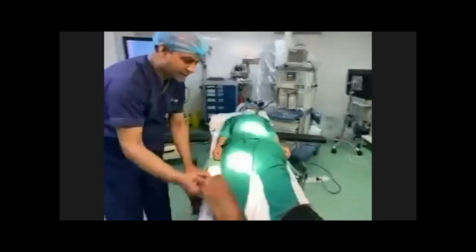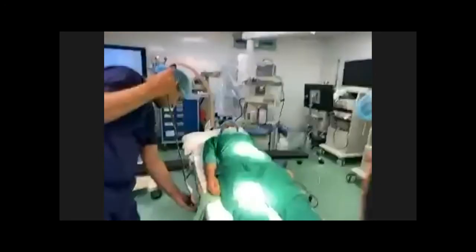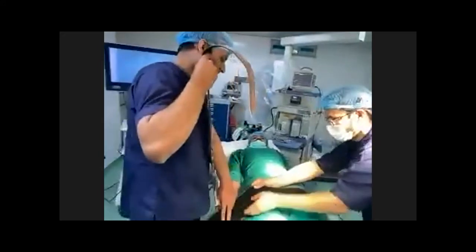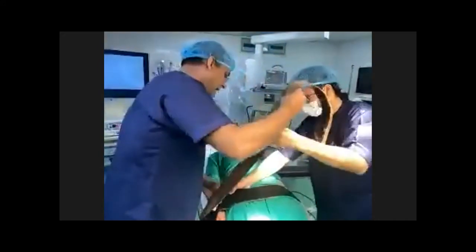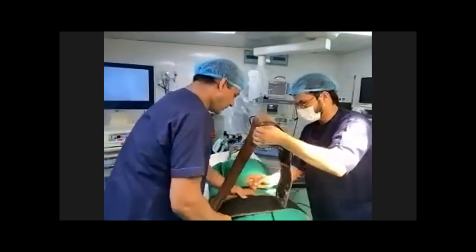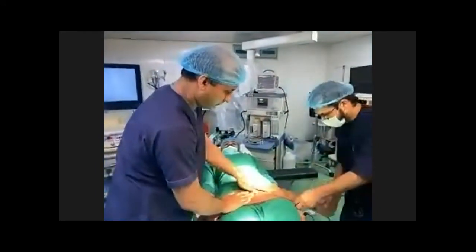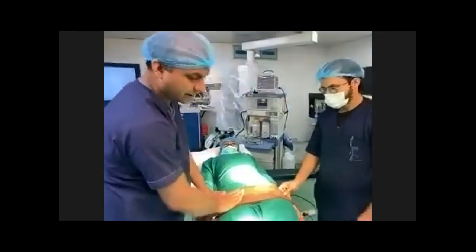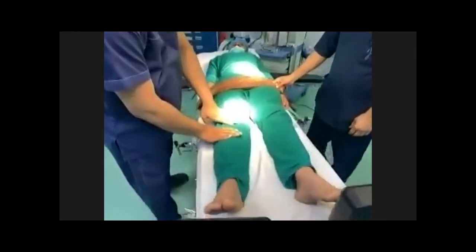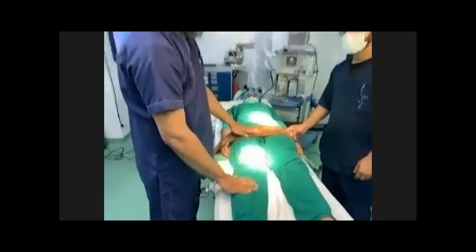This is a belt which is used for the safety of the patient. It is usually tied at the level of the pelvis, the anterior superior iliac spine area, but you can also tie it just 2 inches below the knees. And you can tie it at both ends in different procedures.